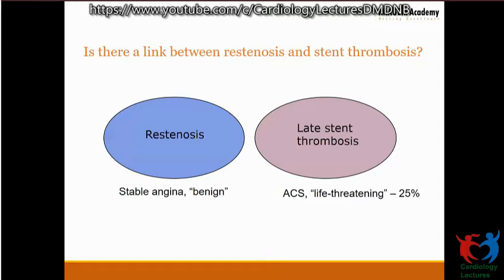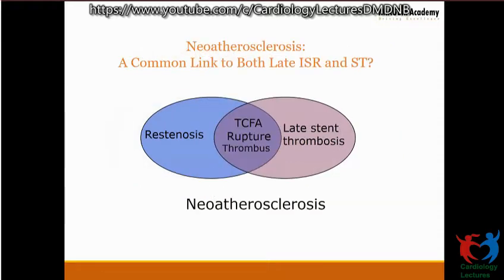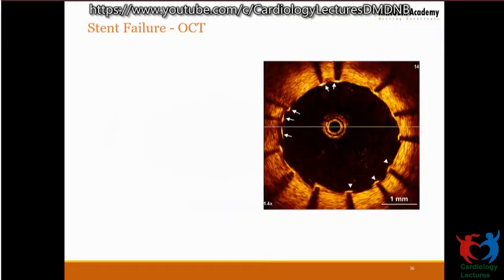So, what exactly is the link between ISR and late stent thrombosis? It is the neoatherosclerosis. The moment a patient develops ISR, he goes on to neoatherosclerotic changes, and it is the neoatherosclerotic plaque rupture which leads to late stent thrombosis. So, OCT is really helpful in this. All these features can be picked up.